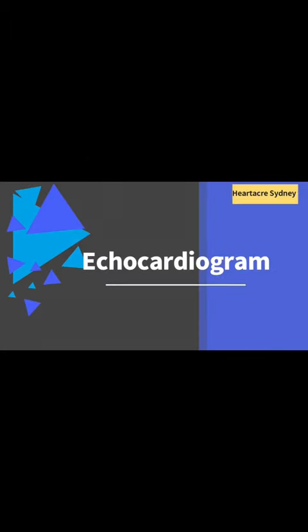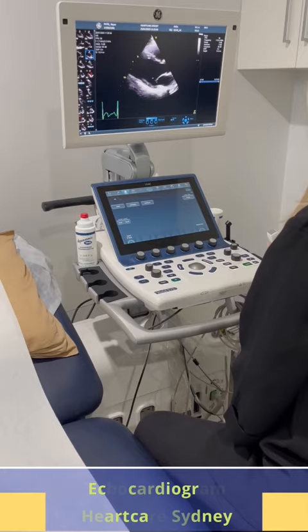An echocardiogram is performed by a sonographer or a cardiologist. The patient lies on an examination table.